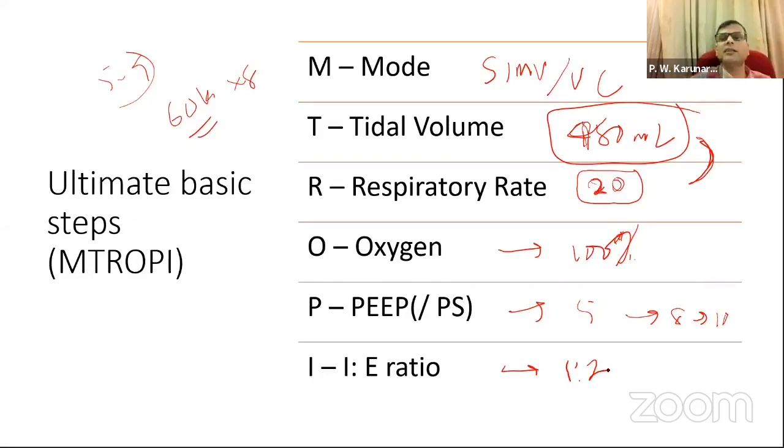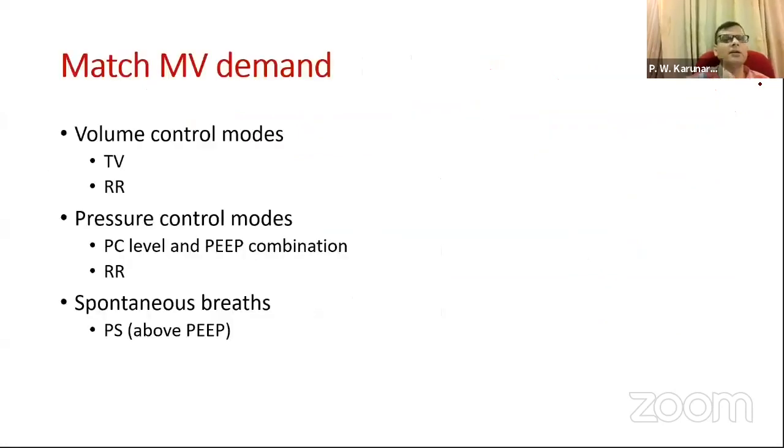But it's important to set the rate and the volume. Don't try to set a very high volume, and don't try to achieve 100% saturation. It's extremely important. And by doing so, don't use very high PEEP or very high tidal volumes. Just try to get your target from somebody who has experience, like an anesthetist or ICU doctor in the hospital, and then manage. I don't have enough time.